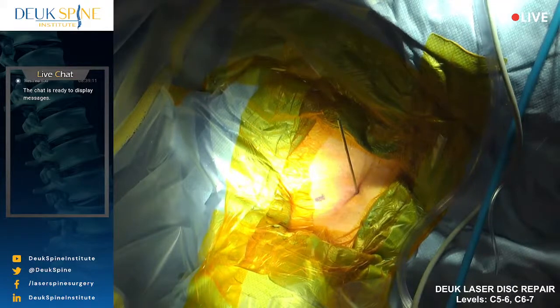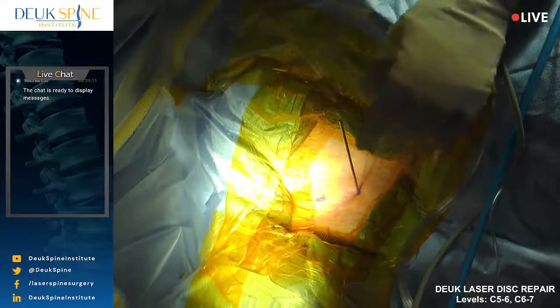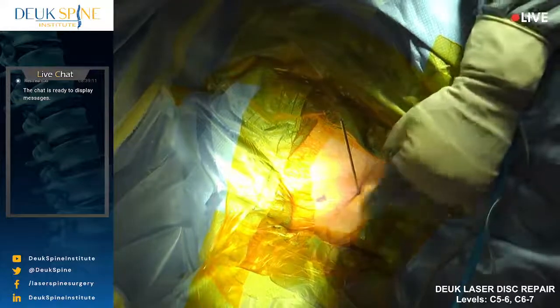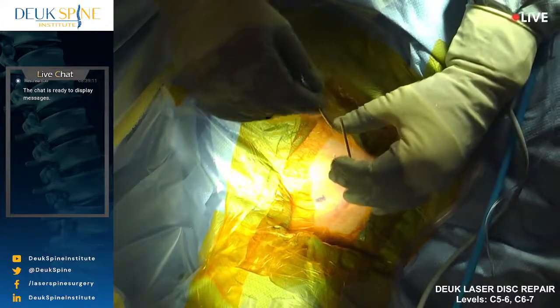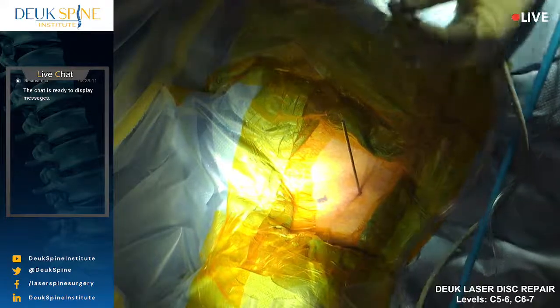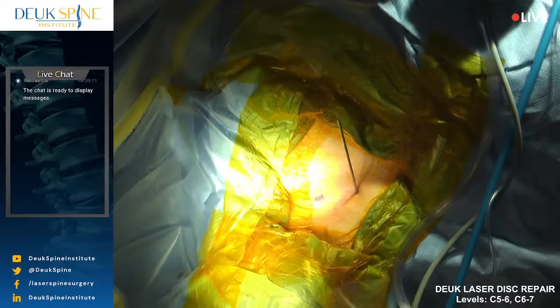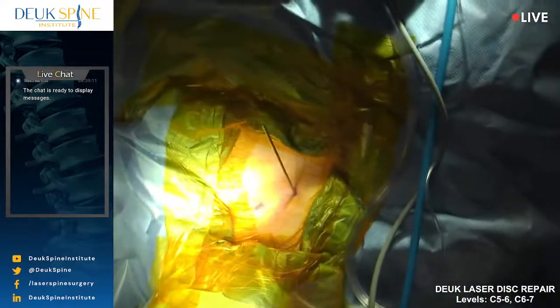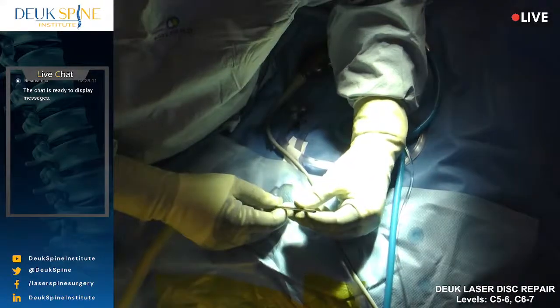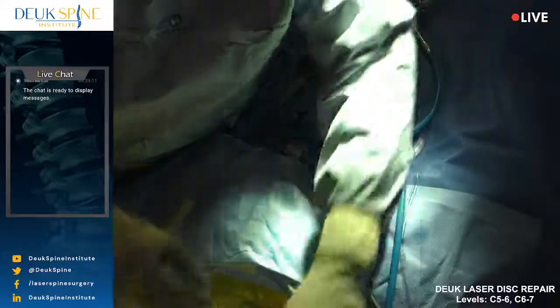Now, I've put a needle and through the needle a guide wire and then over the guide wire the dilator. The dilator doesn't do any damage to any of the tissues in the neck as long as it's applied properly, which I do. Now I'm going to do the whole surgery through this little metal tube. Can you guys see this tube? Diego? Yes, we're looking at the tube. Need you guys to respond, otherwise I don't know if you can or can't. Yep. All right, so this tube is like a coffee straw. The whole surgery is done through this tube.